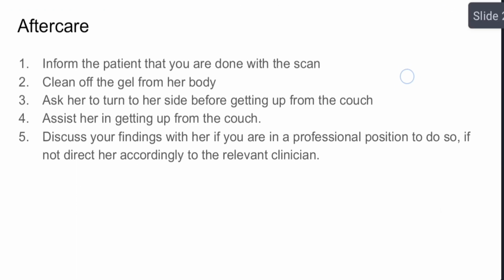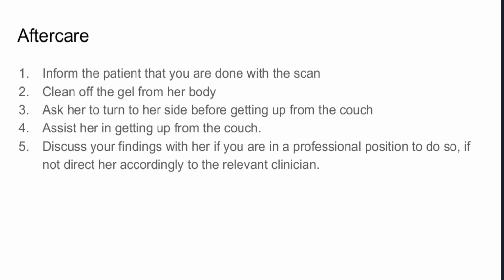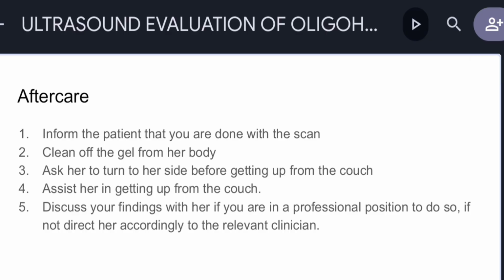Now you have scanned the woman. What is the aftercare? What do you do next? Inform the patient that you are done with the scan. Clean off the gel from her body. Ask her to turn to her side before getting up from the couch. Assist her in getting up from the couch. Next, discuss your findings with her if you are in a professional position to do so. If not, direct her accordingly to the relevant clinician.